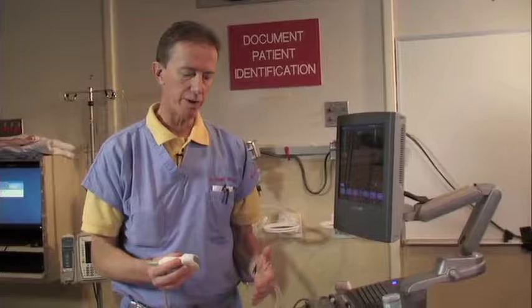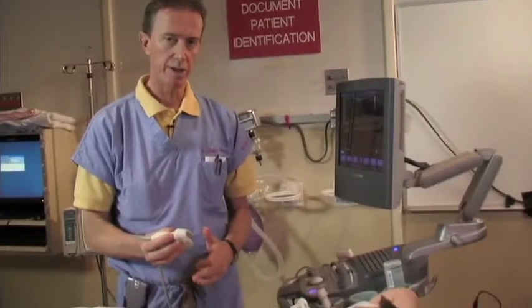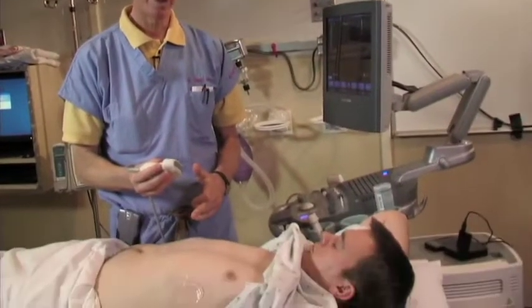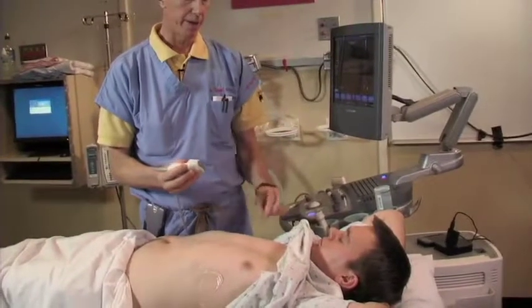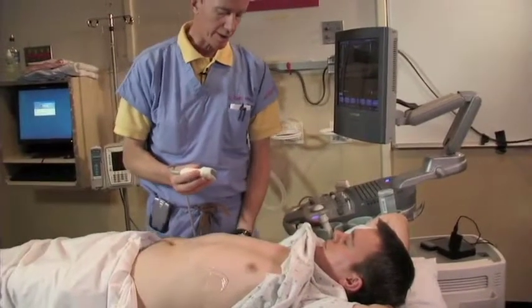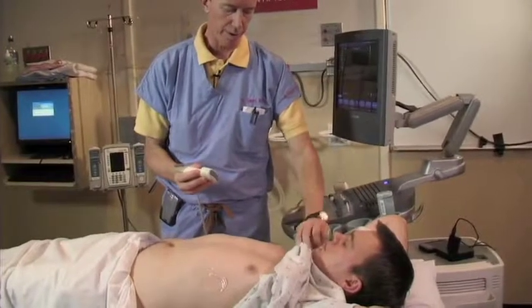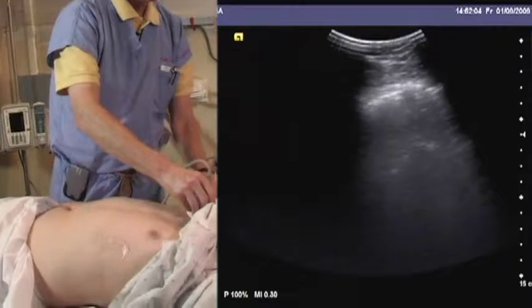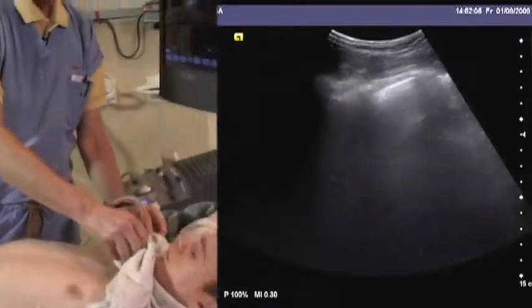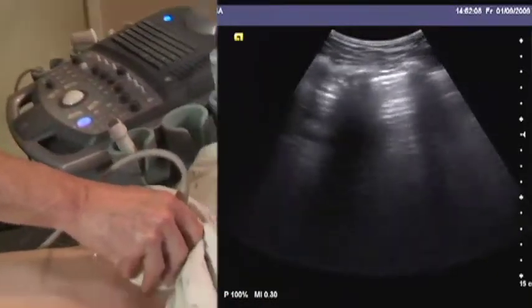The exam consists of evaluation of the pleura from the clavicle to the diaphragm on each side in the midclavicular line. We identify the visceral pleura by placing the probe in a longitudinal direction — at right angles to the ribs.